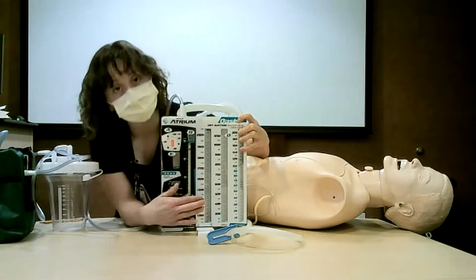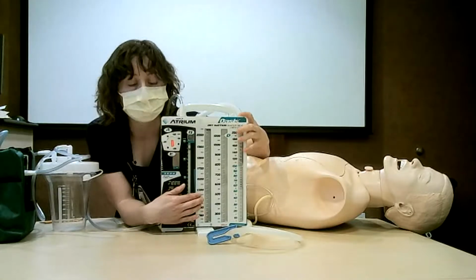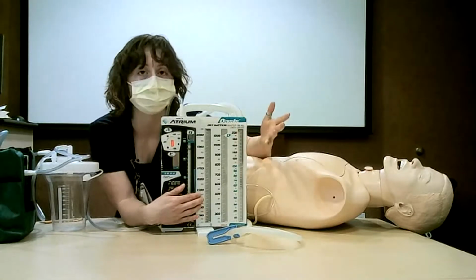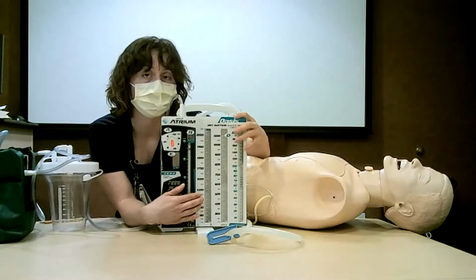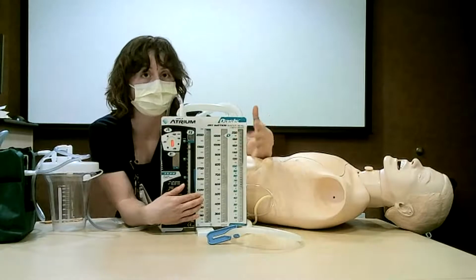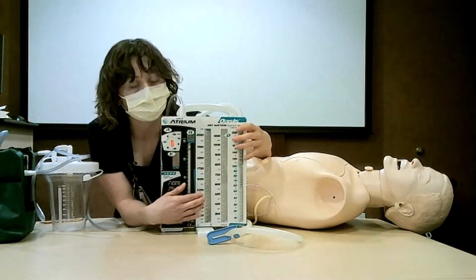You also want to note the type of drainage that's coming out from the chest tube. Depending on what the chest tube is there for, the drainage may look different, but if you do notice a significant change in the drainage, whether it be the color or the amount that you're getting, ensure that you let the surgeon know that as well.